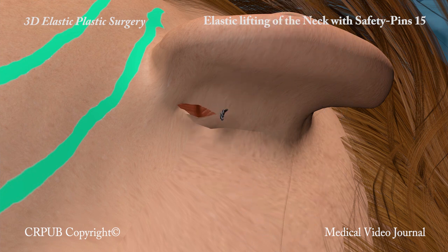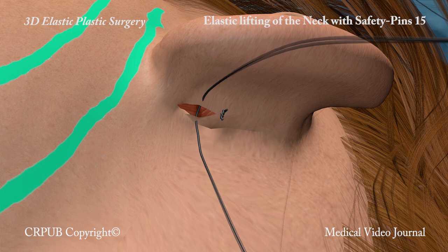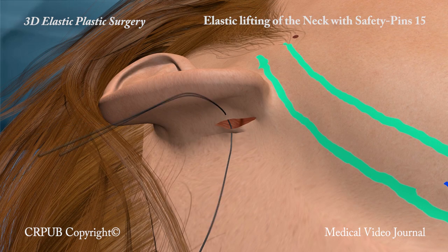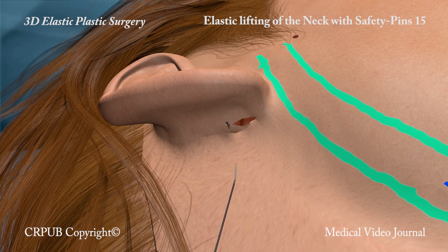Elastic lifting with safety pins is an extremely efficacious procedure in this region, which is the most critical in terms of the permanence of the results.